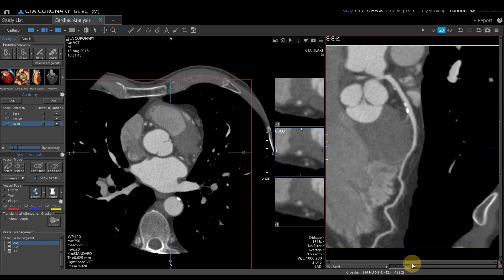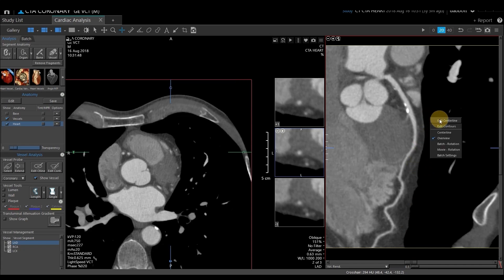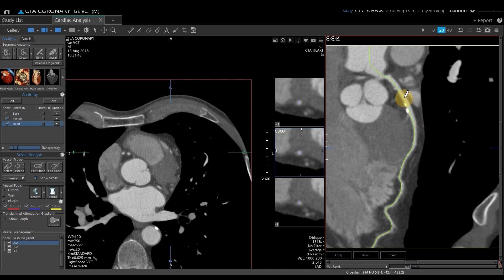If I want to do a vessel analysis, there are a couple of things I need to check. The first is the center line that Vitrea selected for me. To do that, I'm going to right-click and select Edit Center Line. That will pull up a green center line that was utilized to probe this vessel. If I need to change anything, I can single left-click points to edit that line.